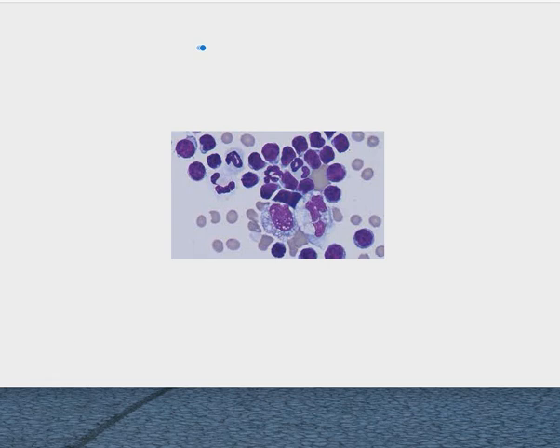I hope that makes sense to you. By the way, this fluid is from a chylous effusion in a cat. The picture on our front page this week is a butterfly catheter gathering an effusion from a chest on a cat. Chylous effusion is going to be one of the cases you do in lab this week, and we do see it occasionally, more often in cats than dogs.